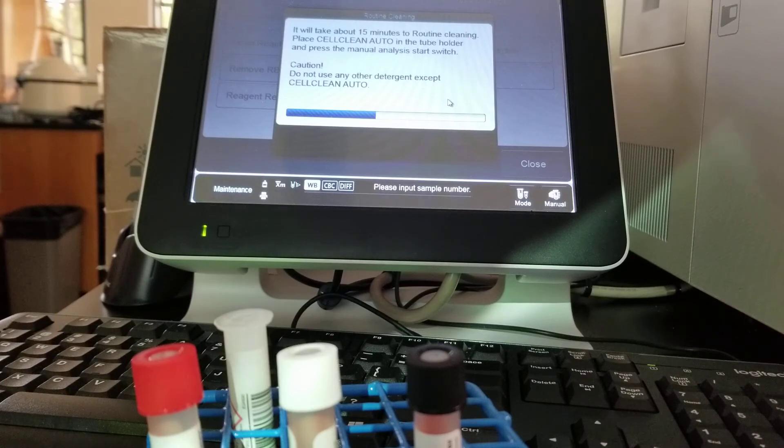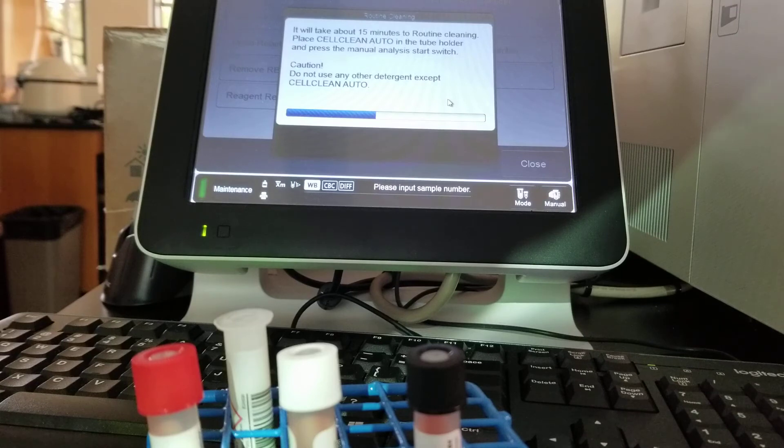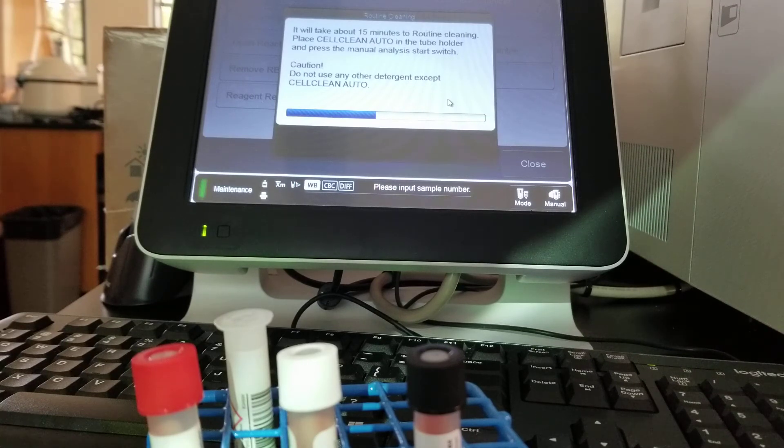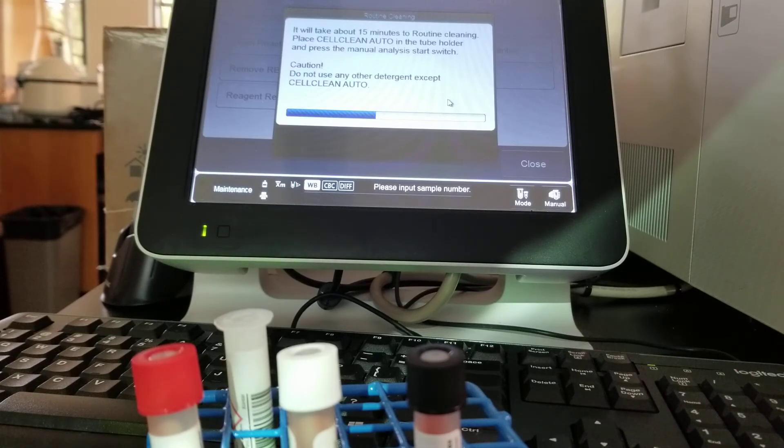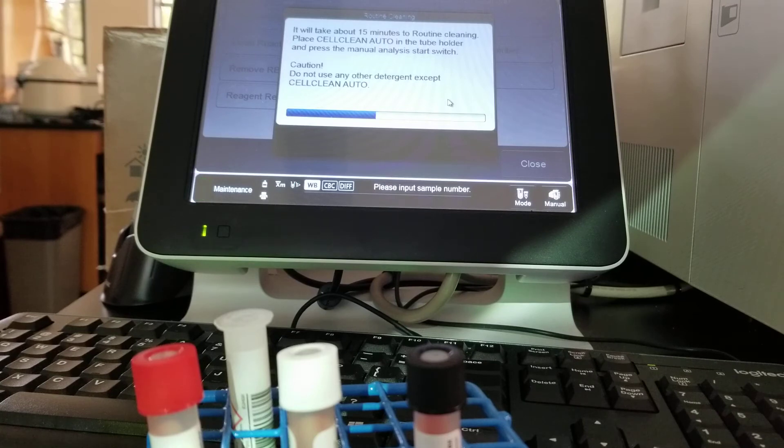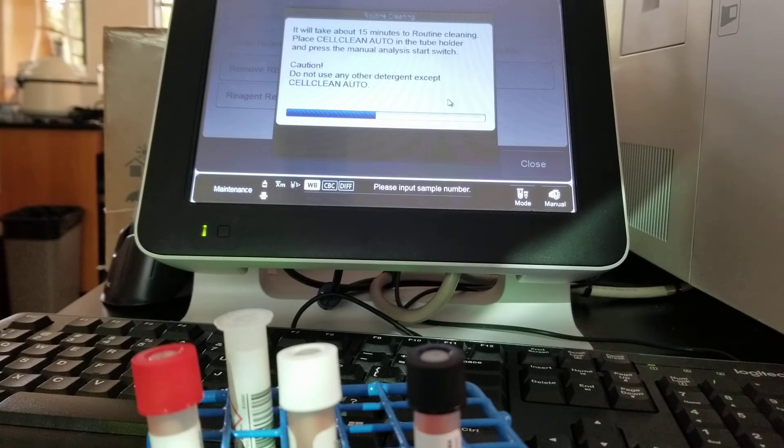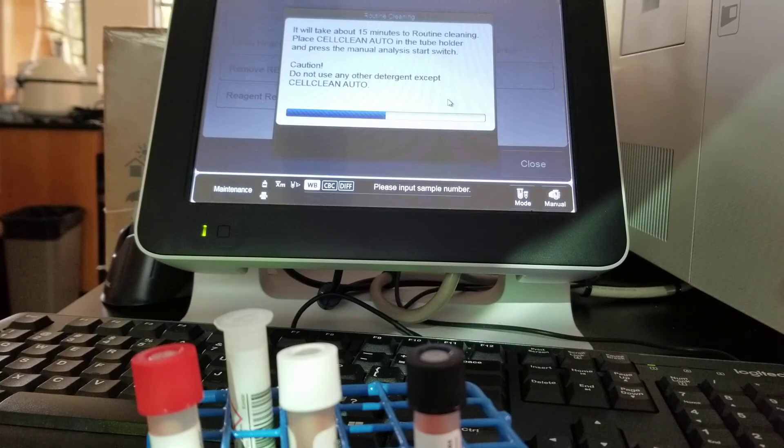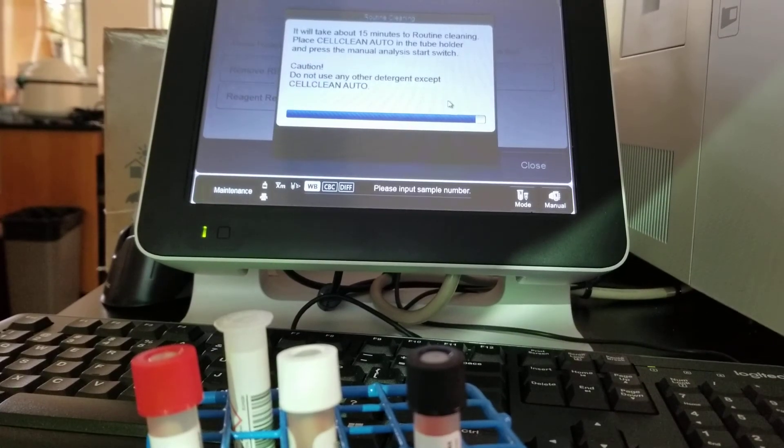We're still waiting on this to finish up. I kind of just wanted to show you what it looks like right before it turns off. This is a walk away procedure. You can absolutely put the cell clean auto on and walk away. It's 15 minutes and then it automatically shuts down. So at the end of class, you don't need to stand here and watch it and make sure it turns off. It absolutely will turn off. I just wanted to make sure you saw what it looks like before it turns off.